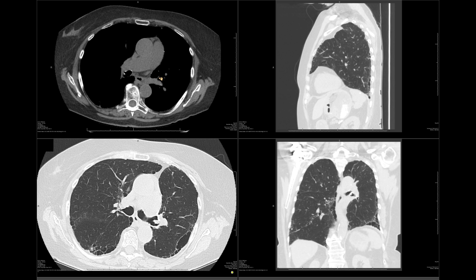This has been an imaging review of the normal appearance of each lobectomy. If you have any questions about this topic or any other chest radiology topic, let me know in the comments below. Thanks.